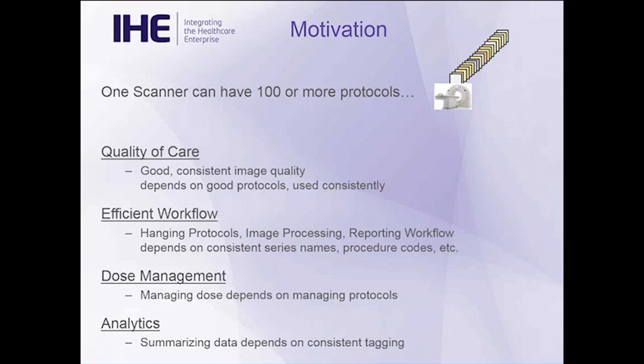And the problem is that many hospitals don't have just one scanner. They've got 2 or 3 or 4 or 5 or 6. And you can see how the problem can quickly scale up, that trying to keep tabs on what protocols are in use, what are the different changes that have been made on the different systems, and particularly if a site has multiple models or even further multiple vendors' systems, managing that huge collection of protocols is quite challenging, to say the least.